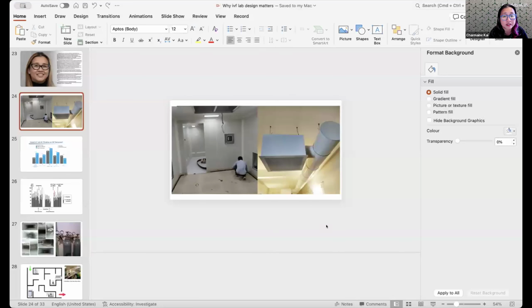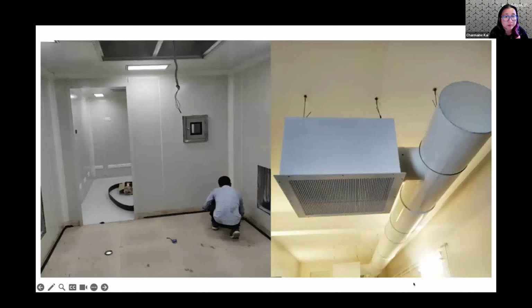In Australia, the only real thing we have to comply with is our National Construction Code, which has to do with safety of patients and safety of staff in terms of fire egress. That's probably the essence of what we need to comply with in terms of the base building requirements.